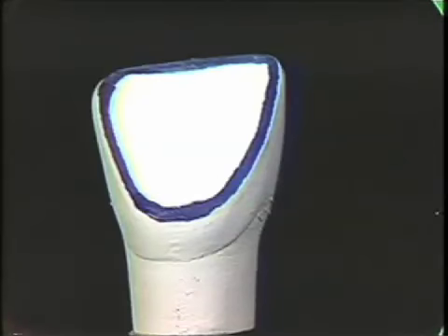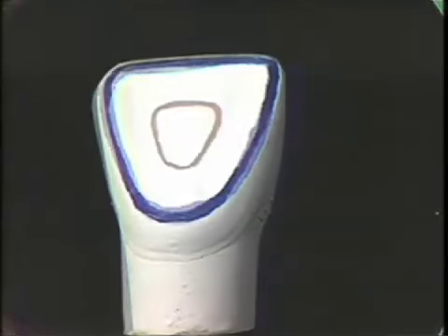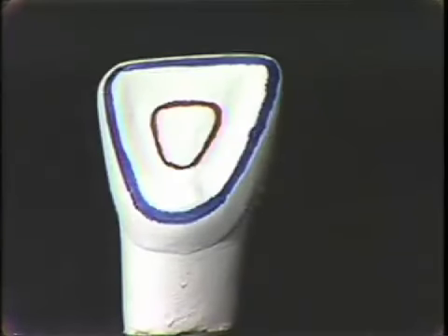As you can see, it's very broad at the incisal and narrows out at the cingulum area, forming kind of a triangular shape. From this, and from the information that we get from the radiograph, we would visualize that the shape of the pulp would be triangular right in the middle of that crown surface, very similar to the shape of the crown.